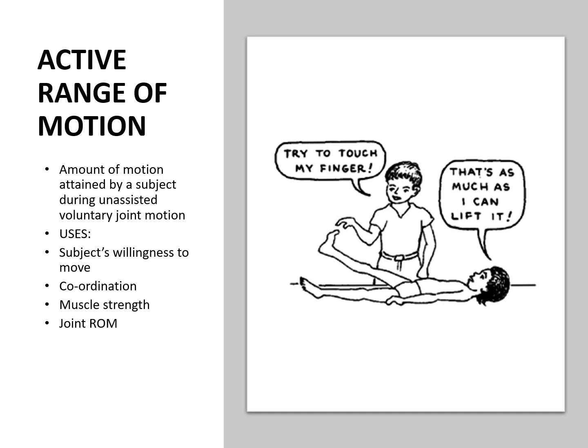And if, instead of shoulder abduction in a clear frontal plane, the patient is not doing a clear-cut, smooth movement, it will tell us about the coordination.